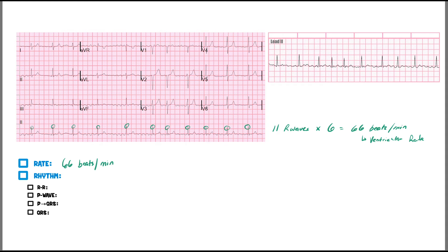Next, we determine the rhythm. Is the R-to-R interval the same? I can already tell just by looking that it is not. Look at these two right here — this is about four boxes, then this one is about two and a quarter boxes. Over here it's five boxes, then six boxes. You don't have to count every single box; just stepping back and looking at the rhythm strip, you can clearly tell this is not regular.